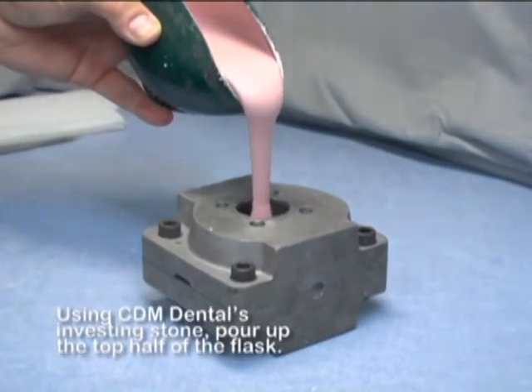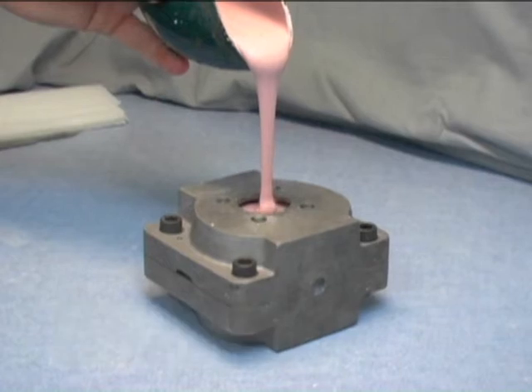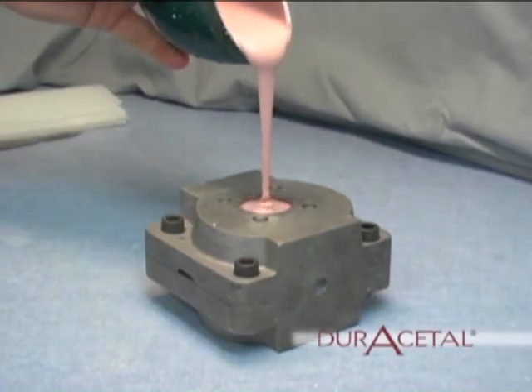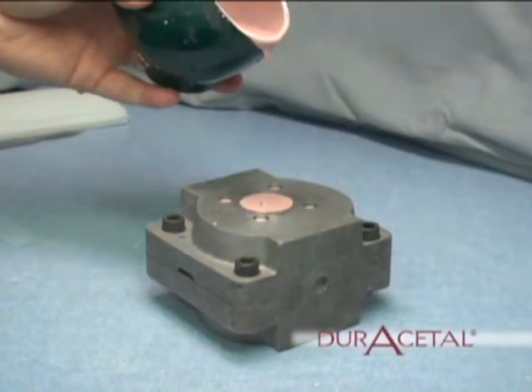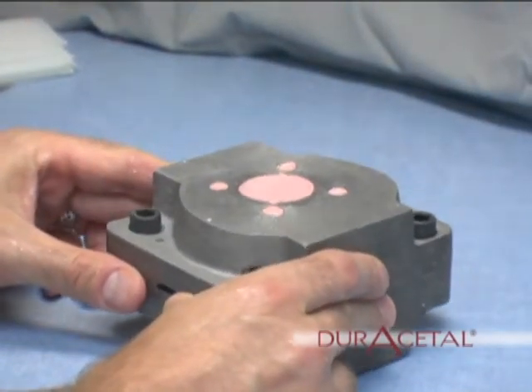Using CDM Dental's investing stone, pour up the top half of the flask. Because of the liquid nature of CDM Dental's investing stone, no vibration is required. Just a few taps on the counter will bring all of the bubbles out of the stone.